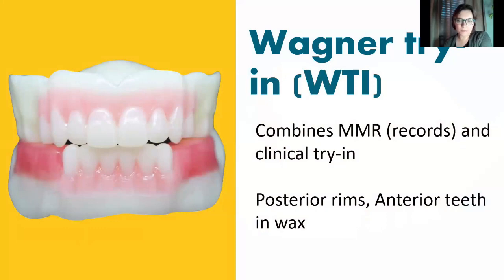The next stop is going to be the Wagner try-in. This is our half and half digital conventional try-in. The maxillary anterior teeth are individually set in wax. So you can actually move the maxillary teeth the same way you would move a conventional wax tooth try-in. This is actually the first workflow we incorporated at the university when we were trying digital denture workflows, because this maintained all of the things that us classic prosthodontists were used to and all of those teaching tools that we're used to. So here, a student would get the opportunity to learn to move teeth in wax, because they have the maxillary teeth that they can move.